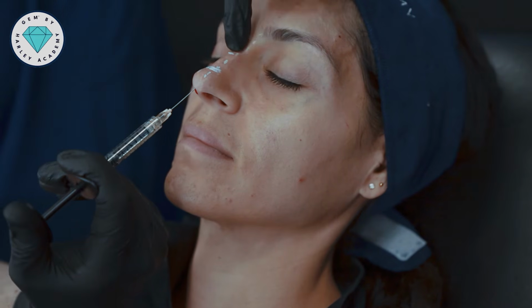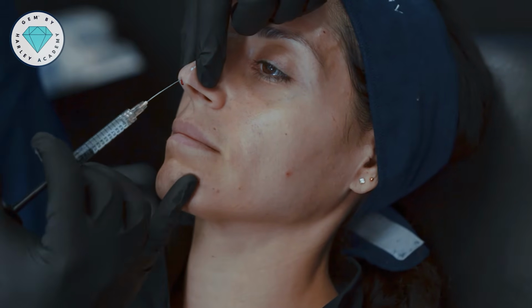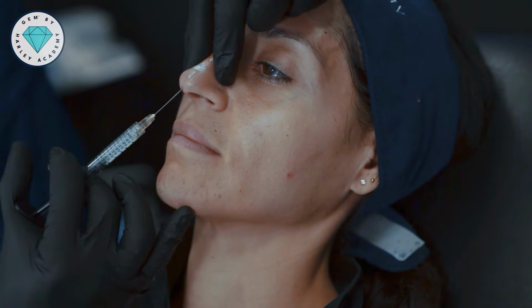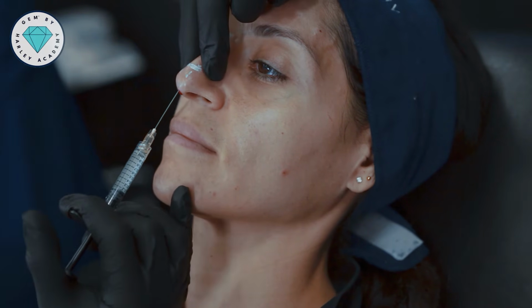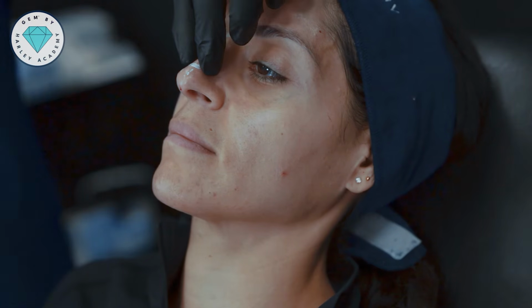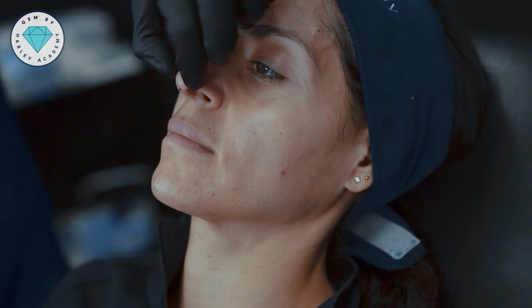I'm not adding any volume to the projected dorsal hump. I'm going underneath it. So I'm just defining the aesthetic lines beneath the dorsal hump at the moment. All the time checking for capillary refill, noticing if there's any blanching or skin discoloration, checking if there's any discomfort with the patient. I always like to see bleeding. If there's a little bit of bleeding at the tip, that means there's healthy perfusion, and so bleeding is good when we're looking at nose injections.